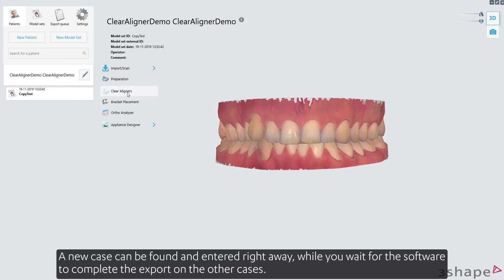A new case can be found and entered right away while you wait for the software to complete the export on the other cases.